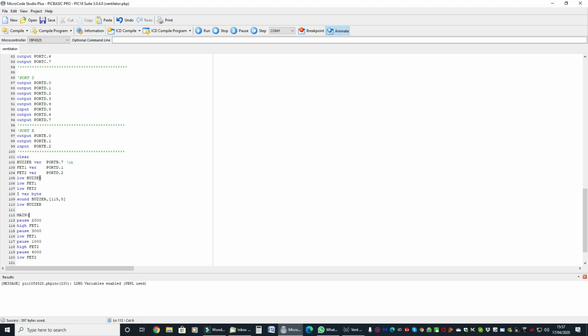So here I'm telling the buzzer and the 2 FETs to be in a low condition or an off state. I is just a variable, byte size variable. Here I'm telling the buzzer to buzz at a frequency of 115 for 500 milliseconds. Okay, here's the main program as a test.